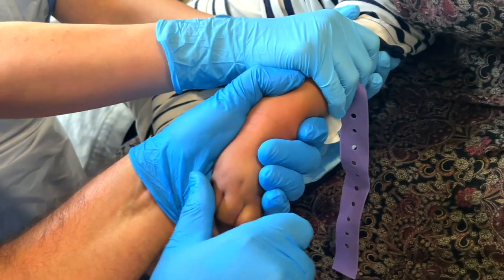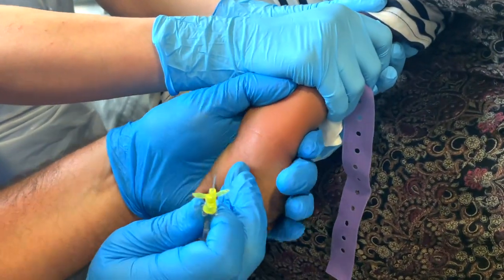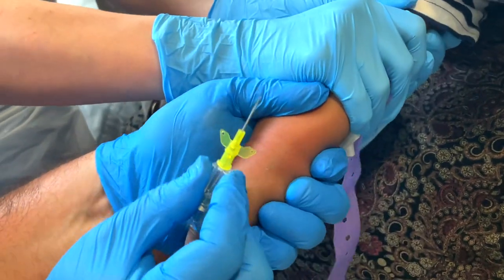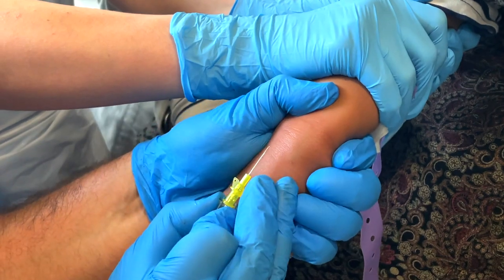We've all got a preferred spot, and mine is the basilic vein on the back of the hand in between the fourth and fifth metacarpal. I love this because it's always there and it's juicy — even in those chubby toddlers where you can't see it, if you go there and hit that spot, once you're in you're going to be able to feed it through really easily. But I'm sure you've got your preferred spot too, and that's totally fine.